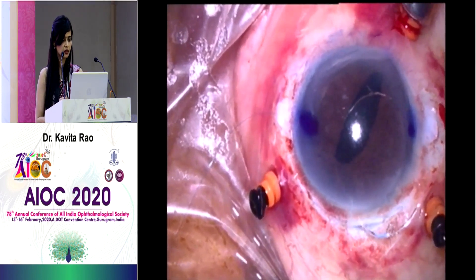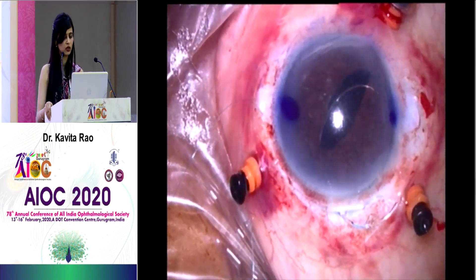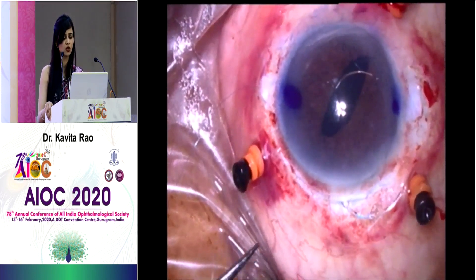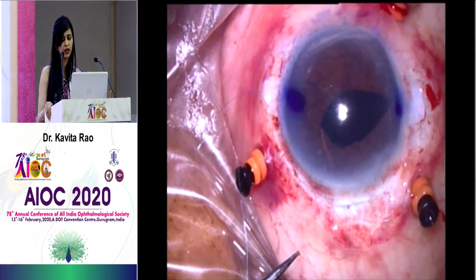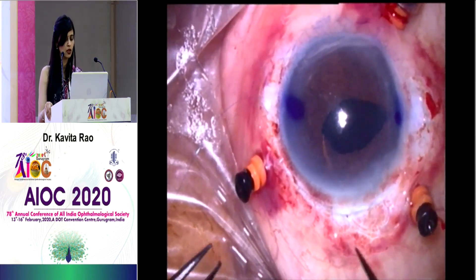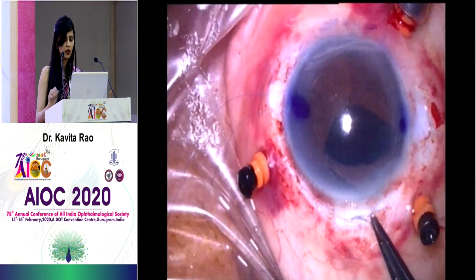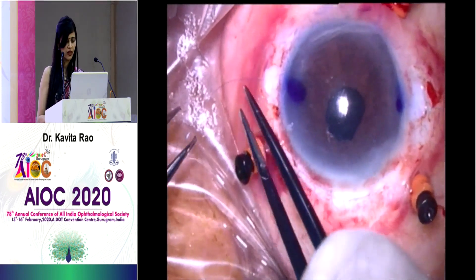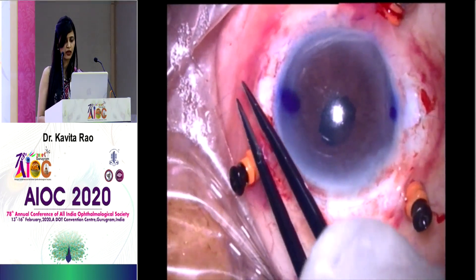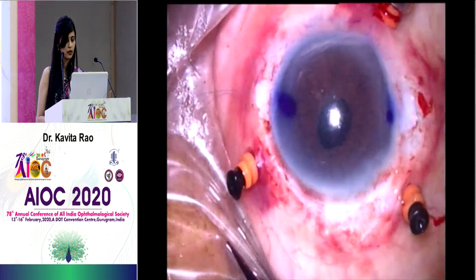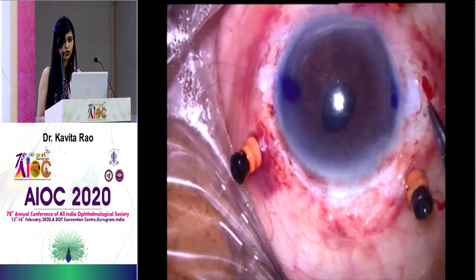This is a four-point fixation. I prefer using either a glued IOL or a four-point fixation — I feel it's much more stable than newer techniques, though I may adapt in the future. The patients are doing very well with this approach. You need to titrate it each time, and when you know the IOL is centered, you pull on both sides and suture. Don't tie the knot too tight.